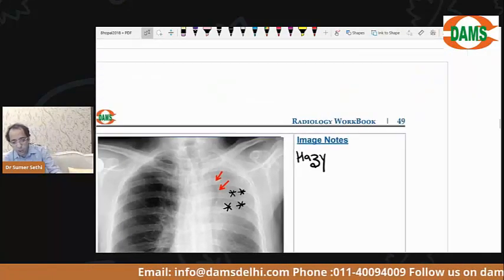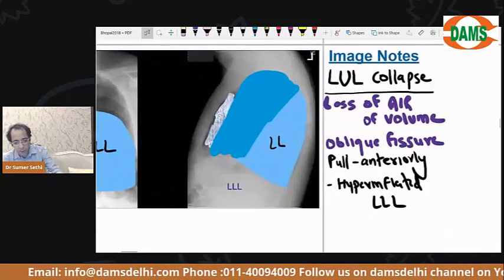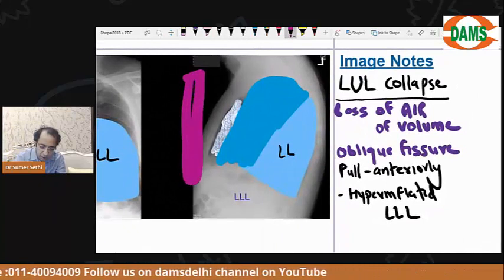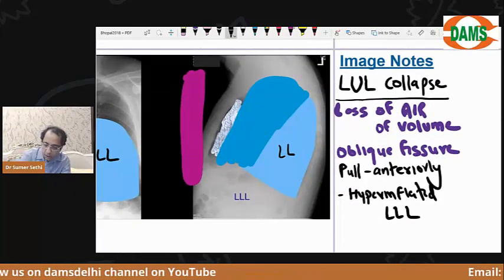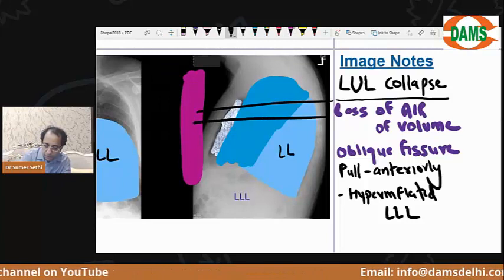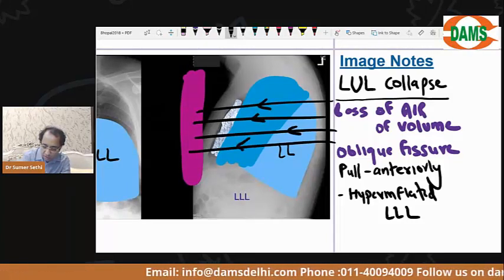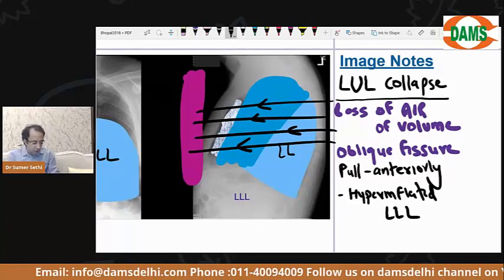Okay. Now imagine, let's see if you can understand. Suppose I keep the X-ray film here and these are your X-ray beams. Listen to me beta, it's tough, it's very tough, but let's see if you can understand.